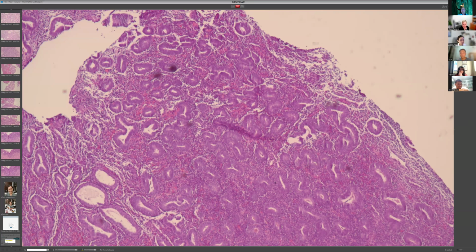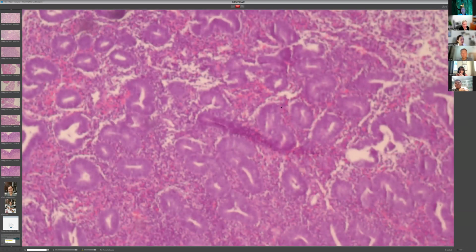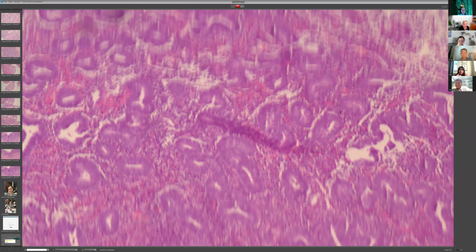These are very nice, rounded, tubule-looking glands. And going in high power, these two glands are almost touching. There's maybe one or two stromal cells in between. So that's kind of a good indicator to assess also. If it's not secretory glands and if you have nice rounded glands and there's minimal stroma in between, then it's probably hyperplasia. I don't know if that answers your question.